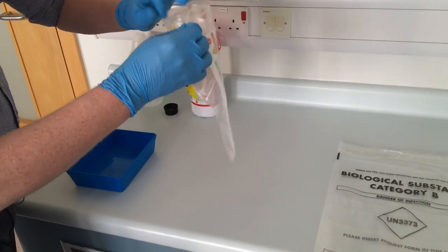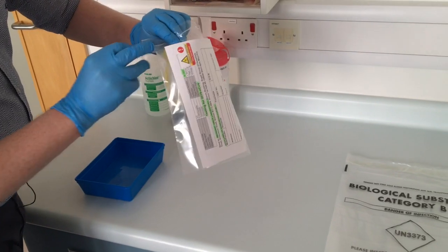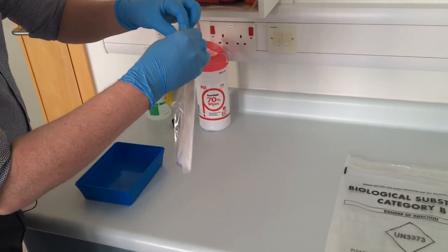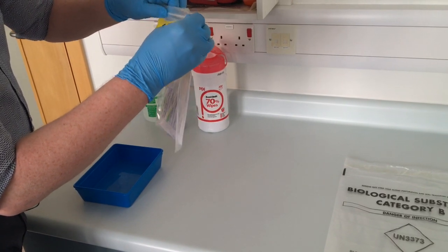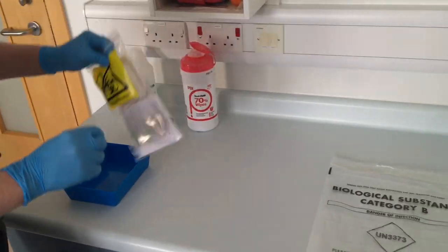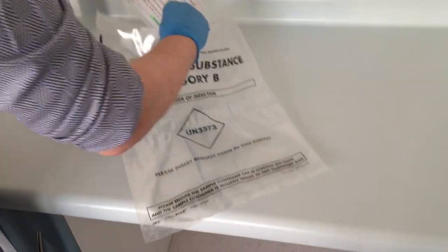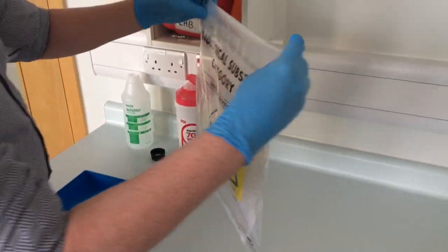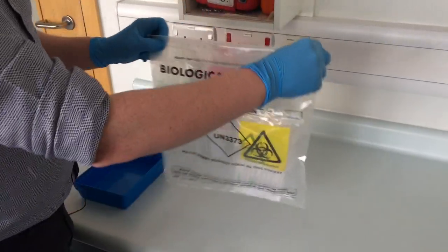This first bag is then put into the second specimen bag. On the back of the second specimen bag I have my pre-completed laboratory request form — it's very important to have all the details on that form. This then goes into our final outer bag, which is sealed up and is entirely safe for portering staff to transport to the laboratory for testing.